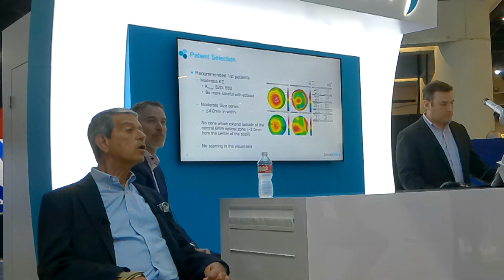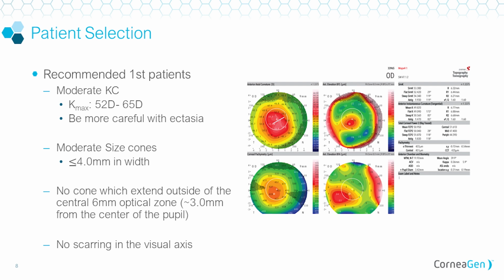Now, you might think this is difficult to place because the corneal tissue is very floppy. And we found even if you go down to very thin inlays, quite easy to place because it does retain some kind of rigidity. So the CorneaGen tissue, being clear, importantly, is also somewhat rigid, that allows for easy placement, as you see here.